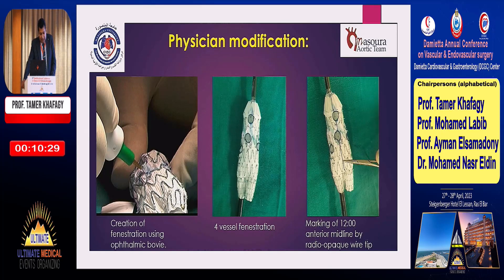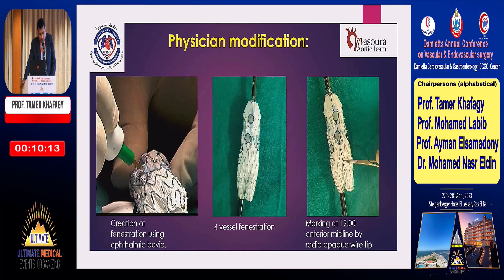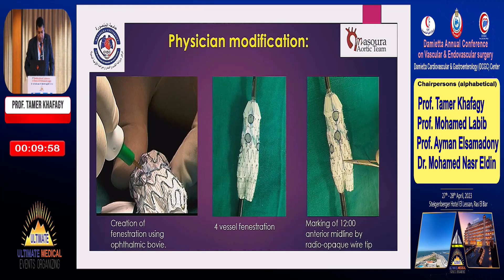You can see how the creation of the fenestration is done using an ophthalmic bovie. After creating the four fenestrations, we mark the edge of each fenestration using the tip of a wire — or in other cases a coil or snare. We also mark the midline anteriorly using a radiopaque wire tip.